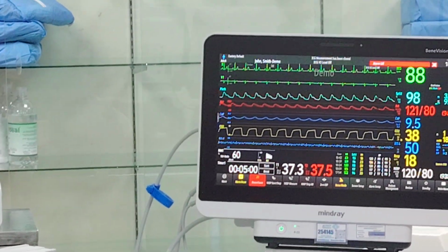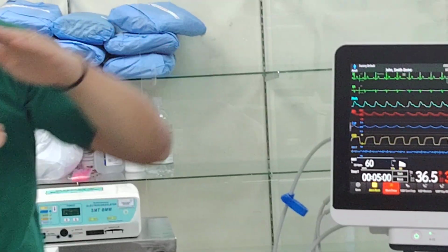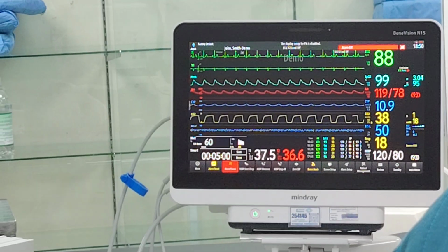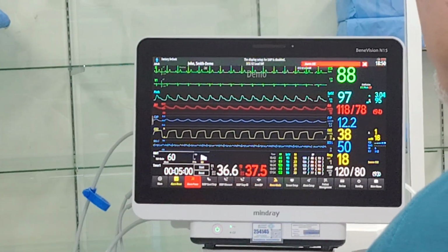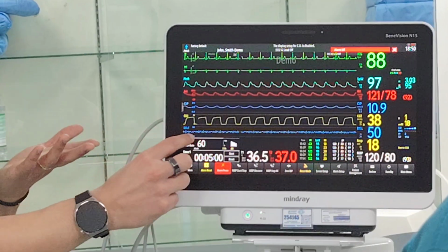So, percent is 100% all the way to 0. After 0, it goes from 4 to 0. The lower it is, the more the patient is blocked. So just remember, when you have counts, you will see this in blue. I wish I could replicate it for you. You will see it in blue.